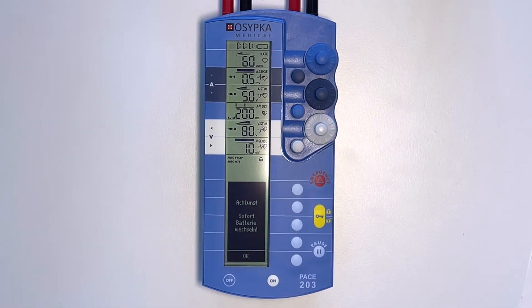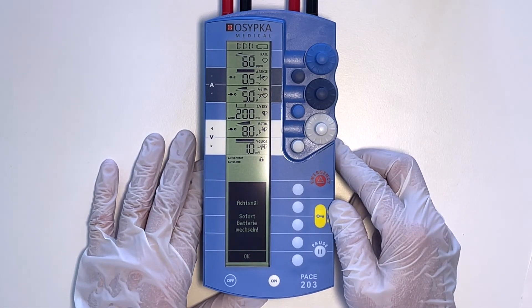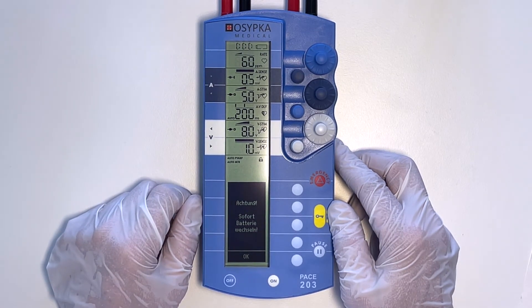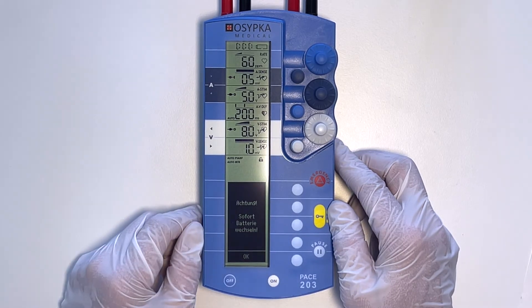The fifth thing to know is how to change the battery. If the battery voltage is no longer sufficient, you can recognize this at the top of the display — the dark bar shows only one segment. In addition, an acoustic warning signal appears and it will give you the message CHANGE THE BATTERY in the lower display.